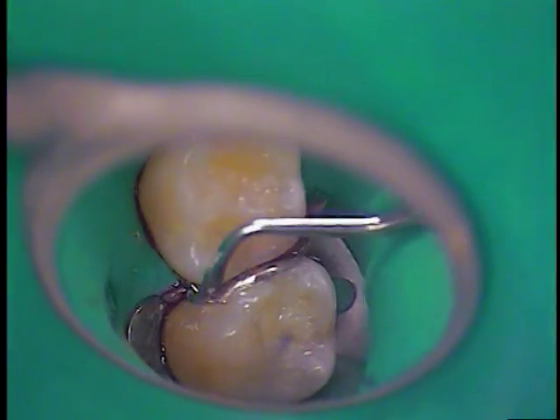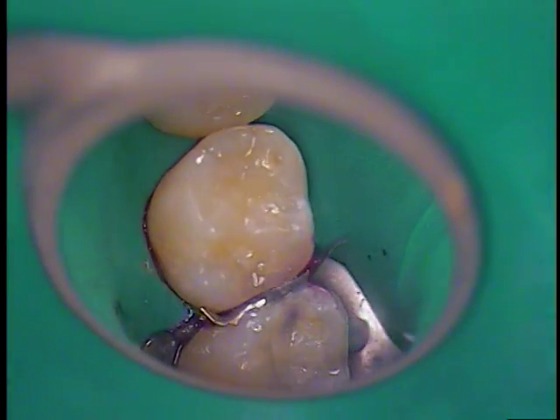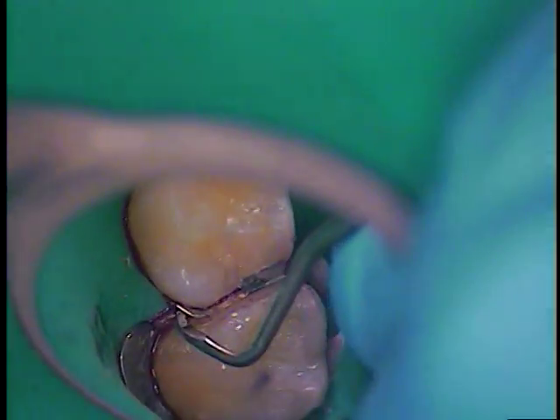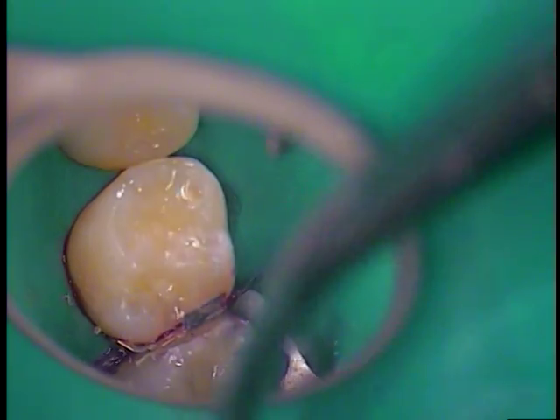I'm going to pick this up again after I remove the band, wedge, and clamp. Coming from the side, coming from the other side, I'll use a scaler next. I went ahead and added to that lingual on three - that's good. Taking away any of that excess - you can see a little bit of flash excess here and there. There's the band, and we've got a nice rolled occlusal embrasure, which is what you want to see.